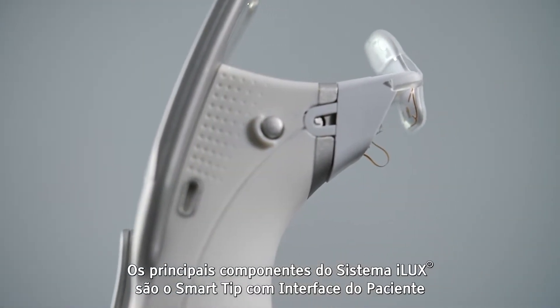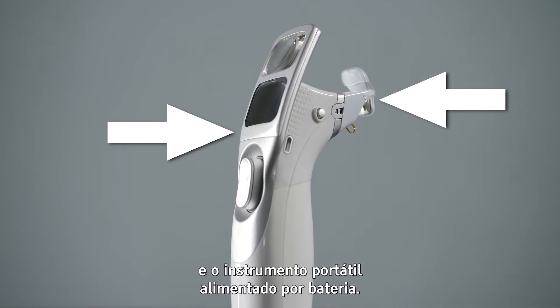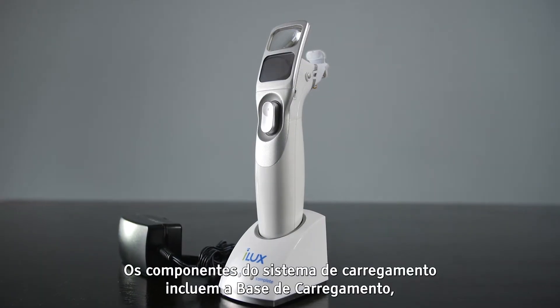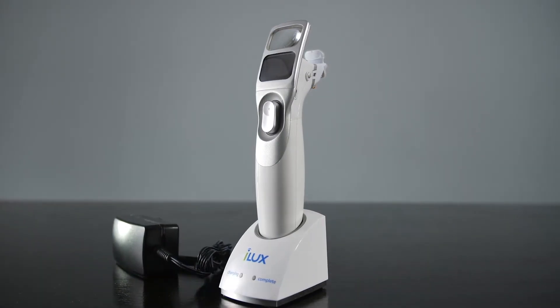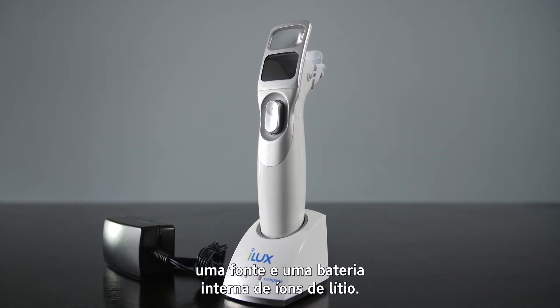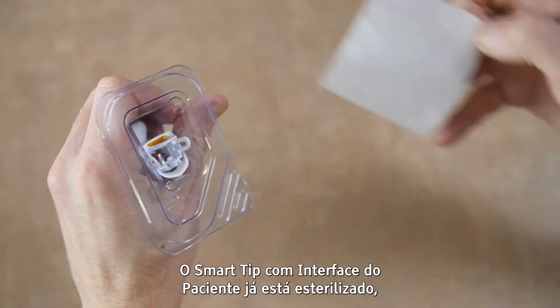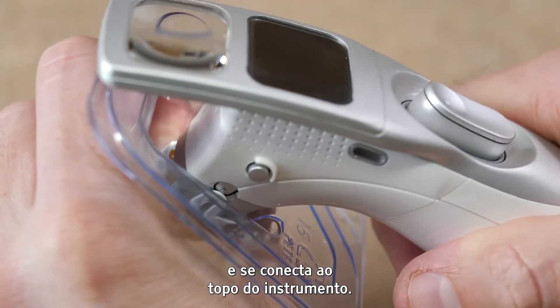The main components of the ILUX system are the smart tip patient interface and the handheld battery-powered instrument. The charging system components include a charging stand, an AC power supply, and a rechargeable lithium-ion battery inside the instrument. The smart tip patient interface is packaged sterile and clips onto the top of the instrument.